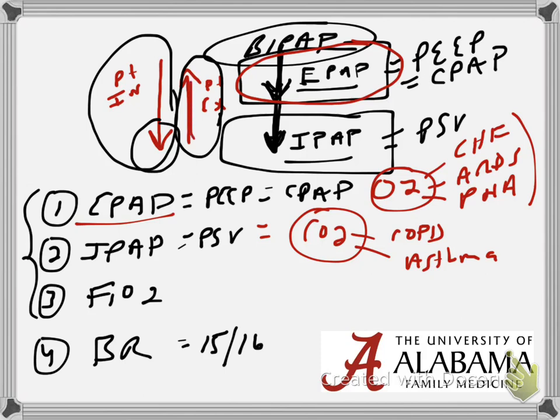You want your COPD patient to be able to exhale all of that CO2, because, of course, that's the whole pathophysiology of COPD in the first place. So in those patients, it's all about the IPAP. You can start a COPD patient at an IPAP of 5, and you can go up to 15 to 17 as you need to correct their CO2. Maybe 5 fixes their CO2 problem. Maybe it doesn't. Maybe you have to continually go up as you get that ABG back.